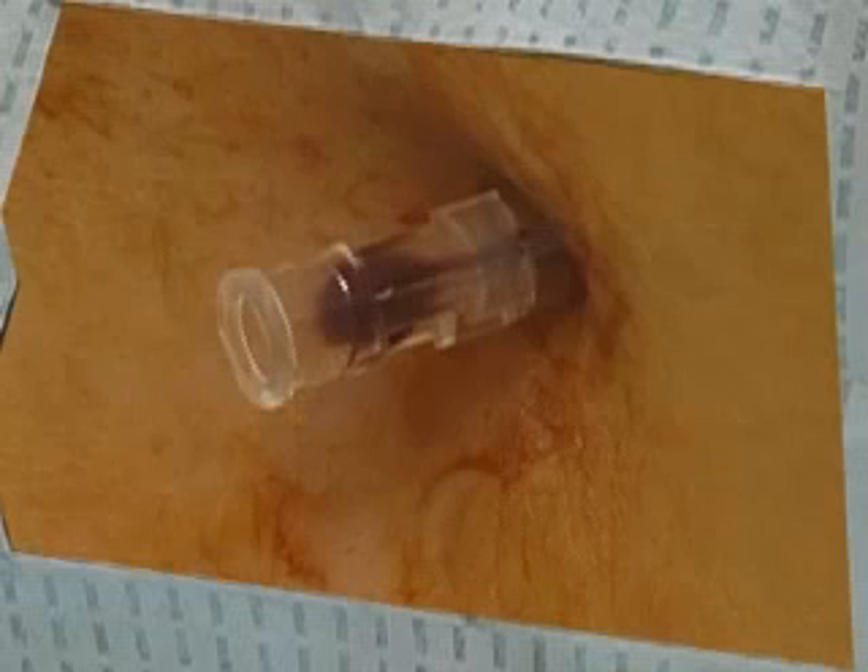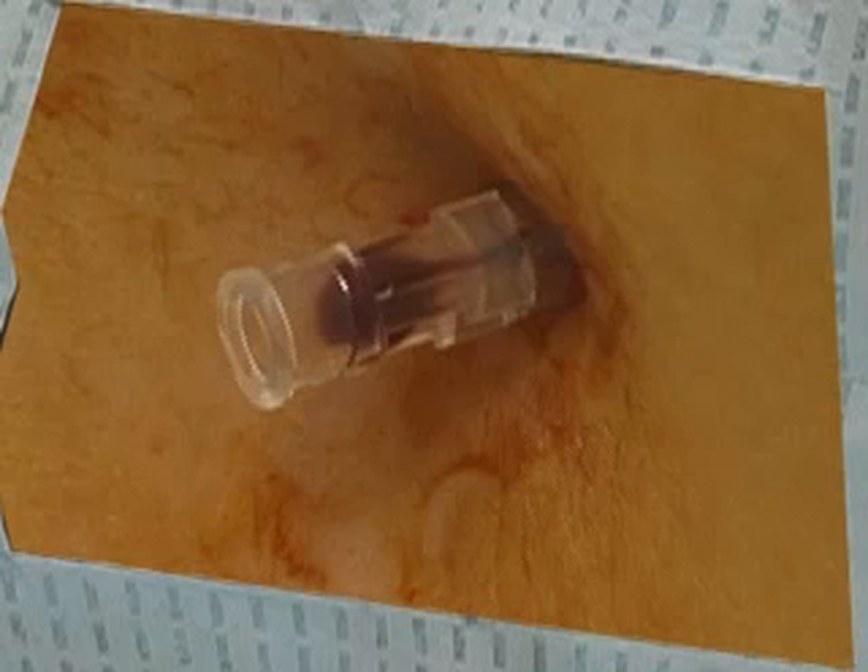If drops of blood enter the needle, it may become clogged. In this case, you should obtain a new needle and enter the site through a different interspace.